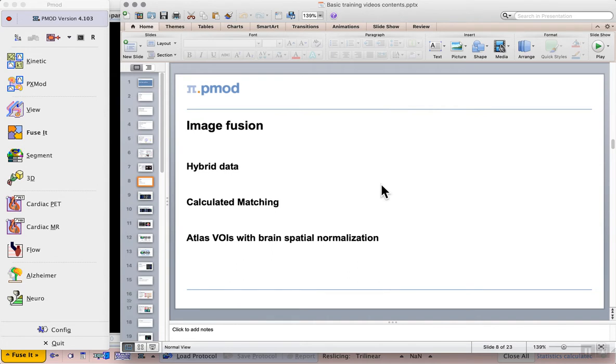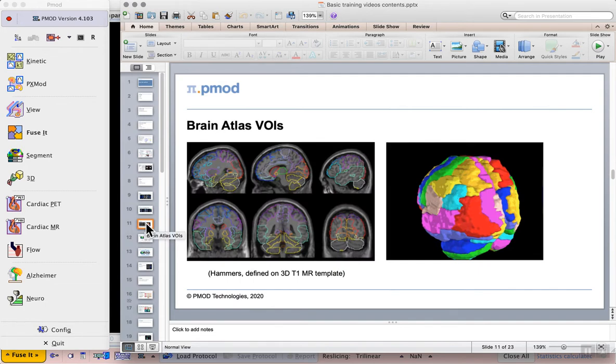We continue with our image fusion section, now moving on to Atlas VOIs with brain spatial normalization. What this means is that we want to use standardized VOIs, this is most common for the brain, and we'll need to match our individual image to a template so that those standardized VOIs can be applied.